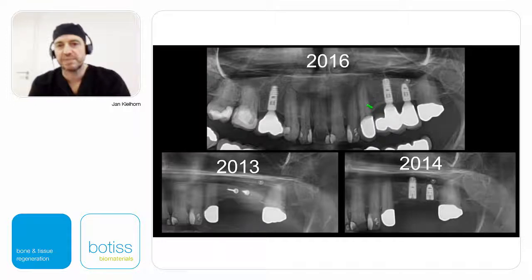See in this aspect, for example, so you really got a cortical regeneration on the top. It gets denser and denser, and absolutely bone stability of what you augmented. See, that is natural bone change in the same system, and here you see that this is a very stable bone.